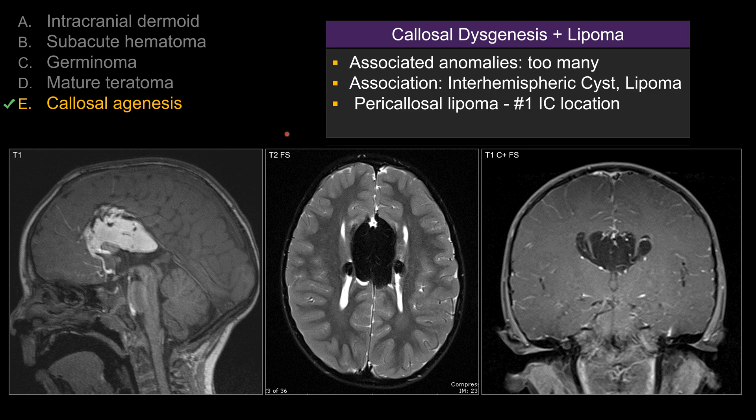Not uncommonly, with callosal dysgenesis or especially with agenesis, you will see associations with other findings such as interhemispheric cysts or sometimes with lipoma.